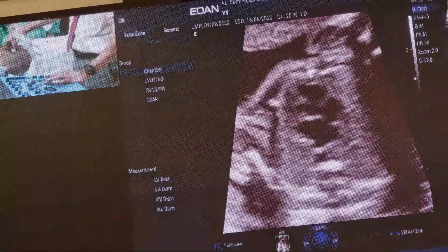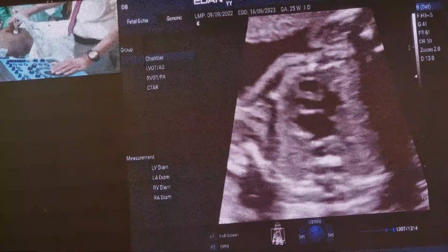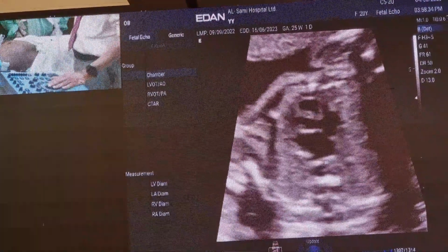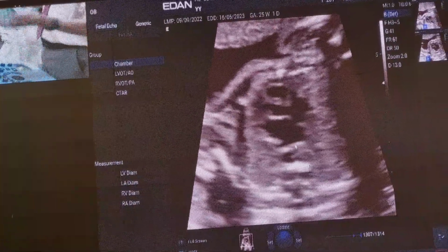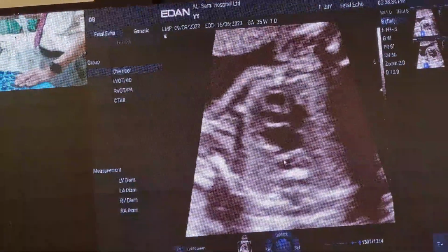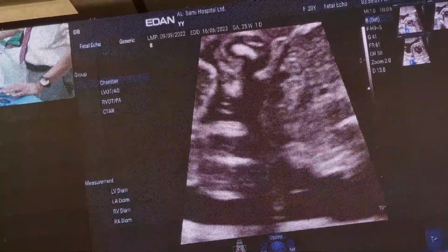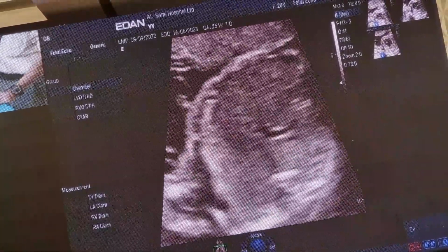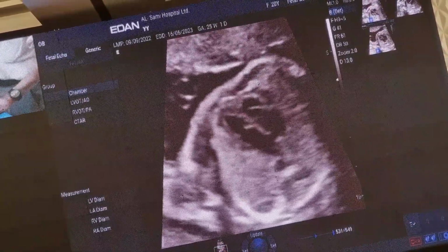We see the inferior pulmonary veins, and as Joyti said again, they sort of hold on to the atria. They pull the atria, with the result that usually this wall of the atria is very taut because the pulmonary veins are holding on to it. And we see some distance between the descending thoracic aorta and the left atrium, which is quite normal. Okay? And then we have looked at the atria, we look at the ventricles, and again we look at the morphology of the ventricles.